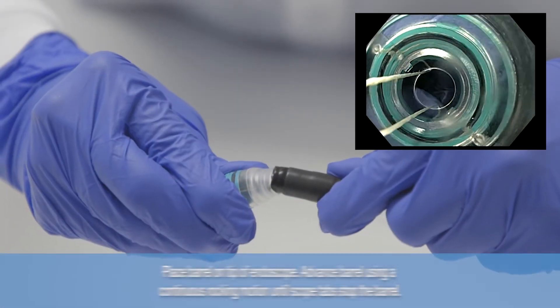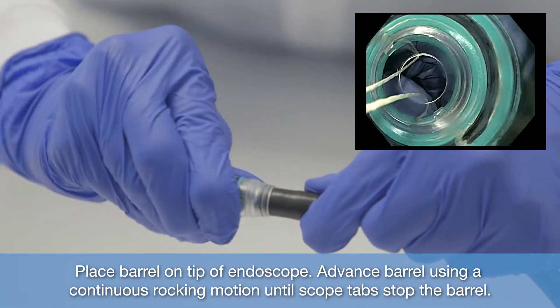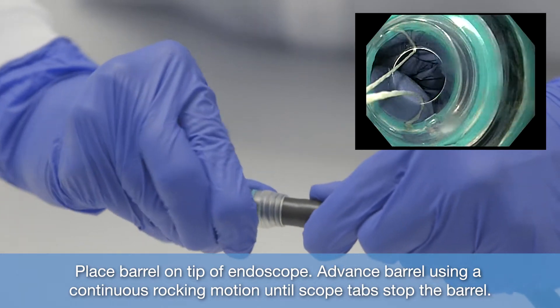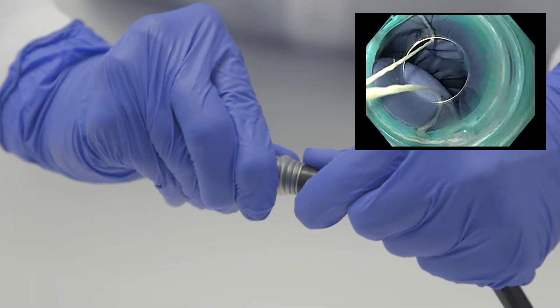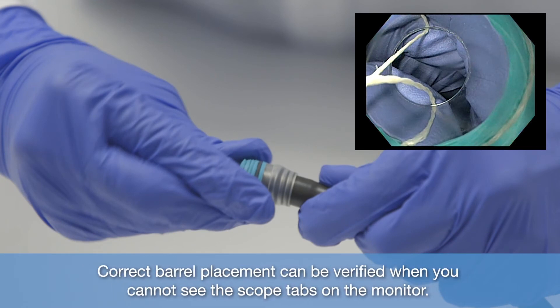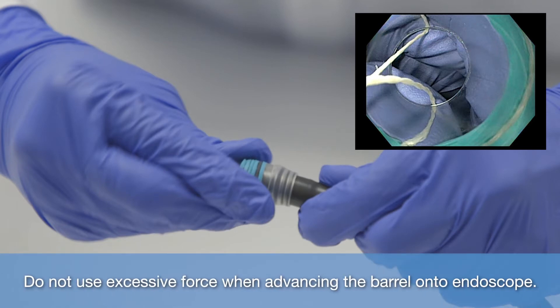Place barrel on tip of endoscope. Advance barrel using a continuous rocking motion until scope tabs stop the barrel. Correct barrel placement can be verified when you cannot see the scope tabs on the monitor. Do not use excessive force when advancing the barrel onto endoscope.